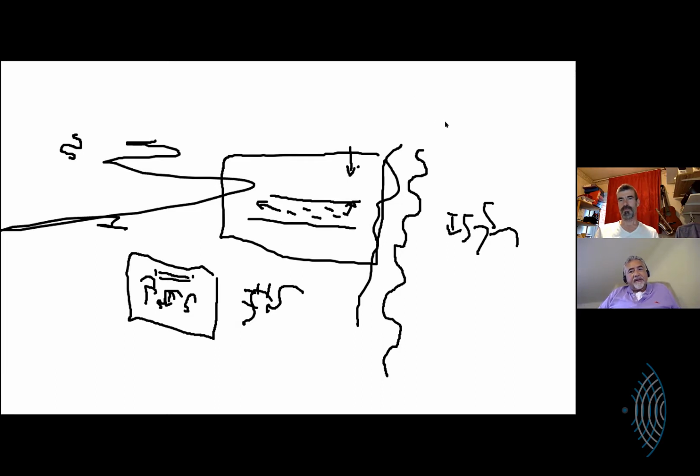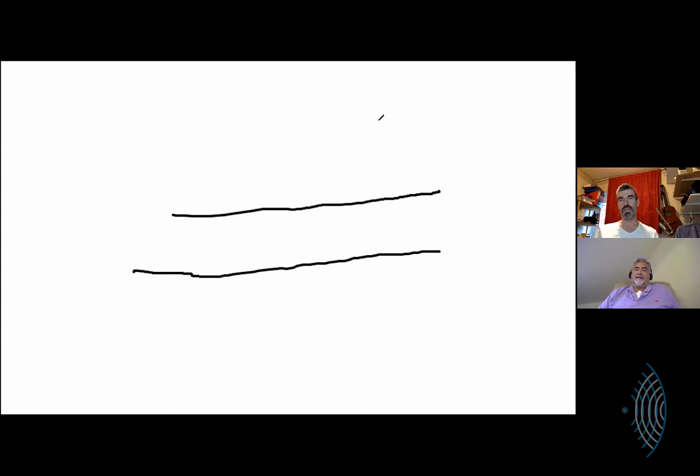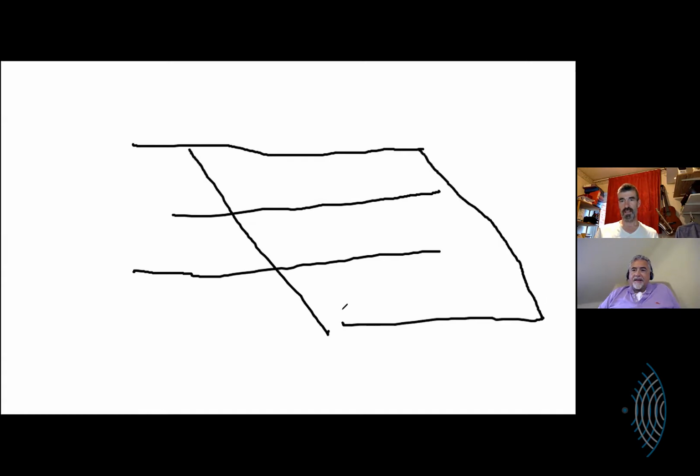It doesn't. You don't see sideways movement with Doppler. The reason you see anything at all is because if you're in a tube there and your probe's up here, you can steer the box, as previously discussed, which is what people do on their carotid scans.